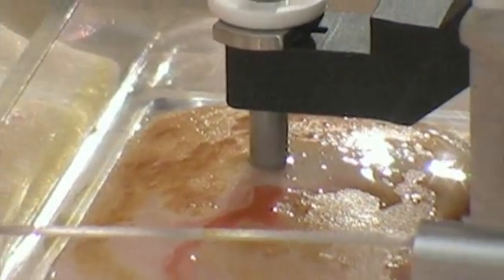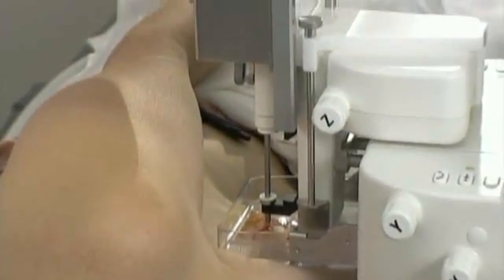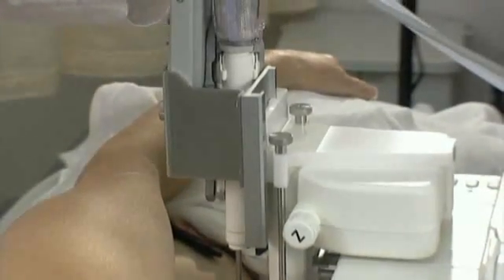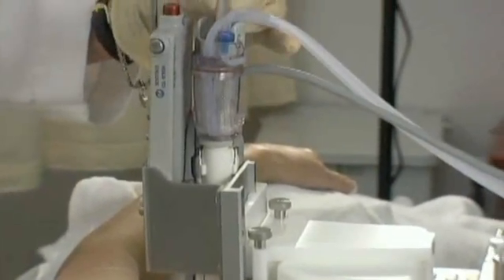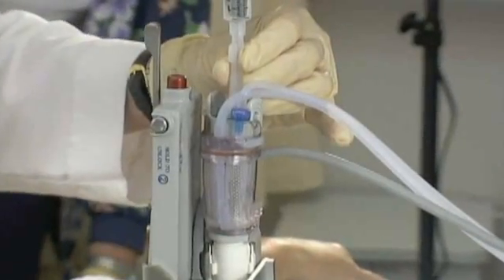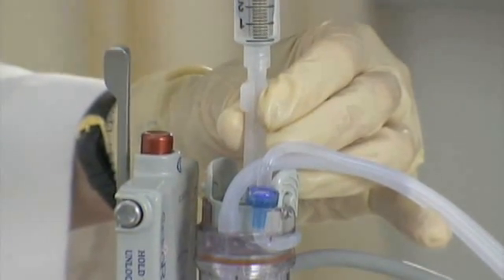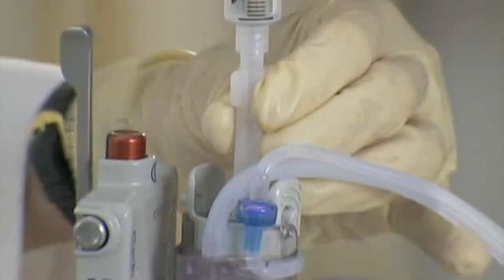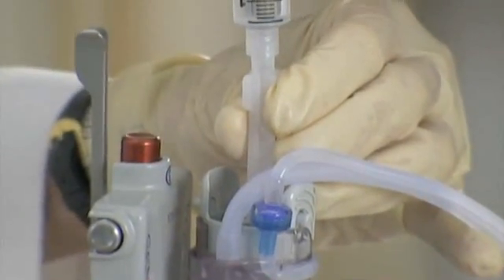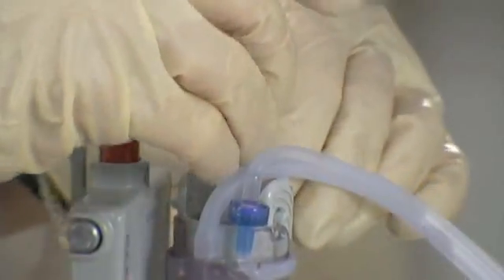We're going to take a couple of stereo pictures. Next, I'm going to deliver some anesthetic through the needle that's already there. That's done easily with the Centerex needle by marrying the syringe with the introducer into the biopsy device. I'm delivering local anesthetic right to the area where we're going to take the biopsy samples so that you won't feel anything. The needle has turned around the clock as I've injected the additional local anesthetic.